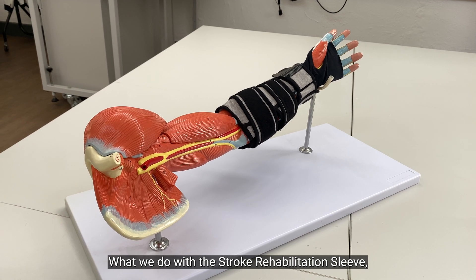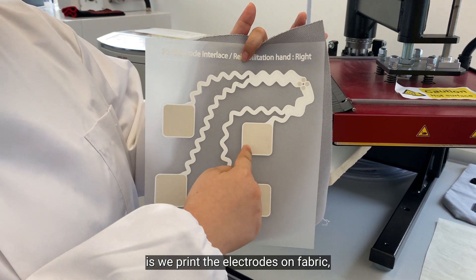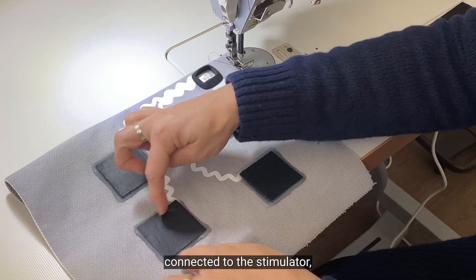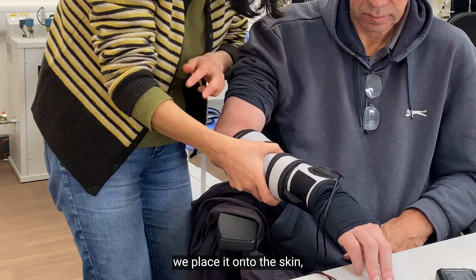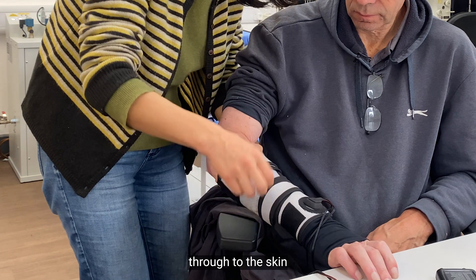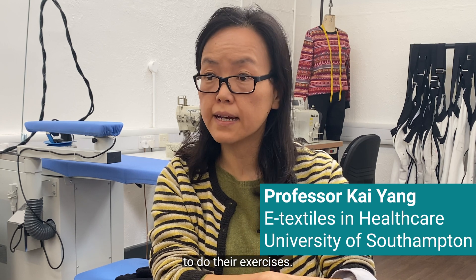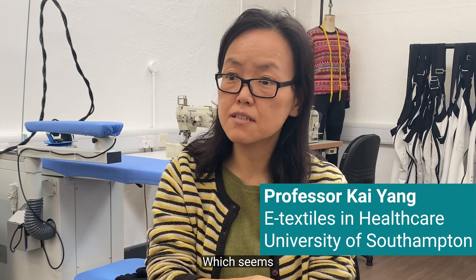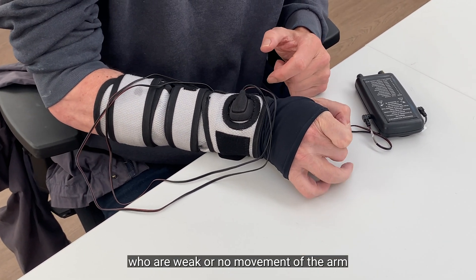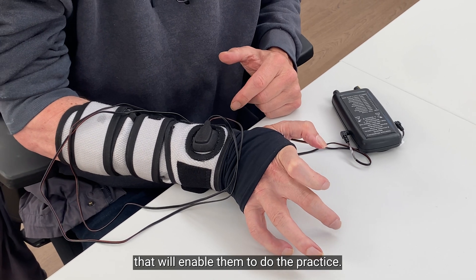What we do with the stroke rehabilitation sleeve is we print the electrode on fabric. So when this is connected to the stimulator, when you place it on the skin, it will send the current through the skin to stimulate the motor nerve, which will enable people to do the exercise — which seems extremely simple, but for stroke patients with weak or no movement of the arm, that will enable them to do the practice.